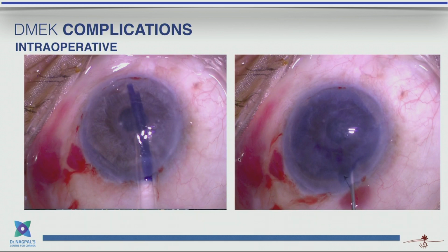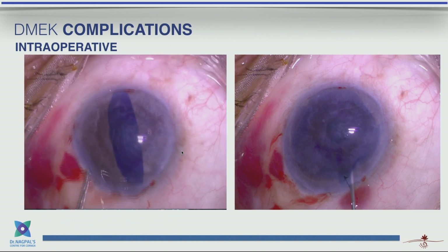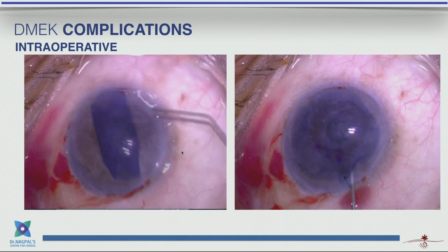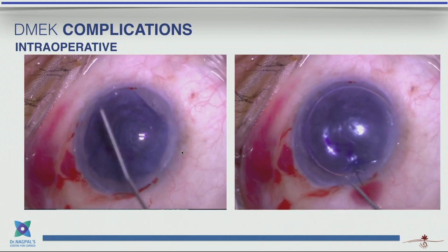Yeah. So this is a straightforward case again, which went in the right way, and then it was fairly easy to open it up just by tapping it, and then you put an air bubble and you can see the F mark.